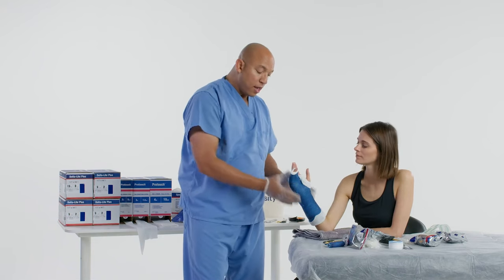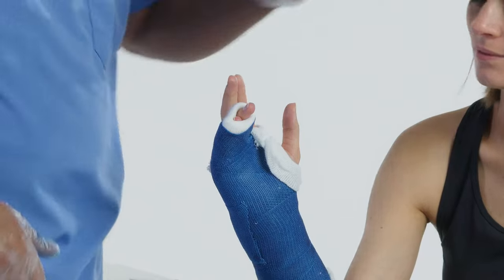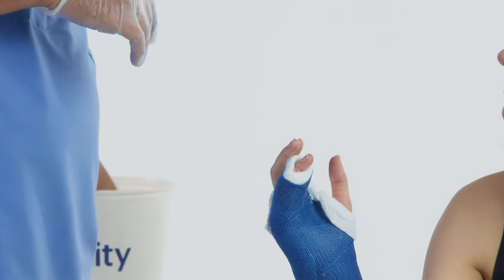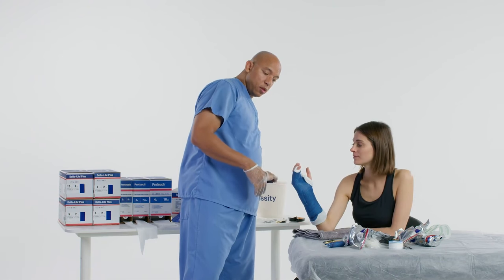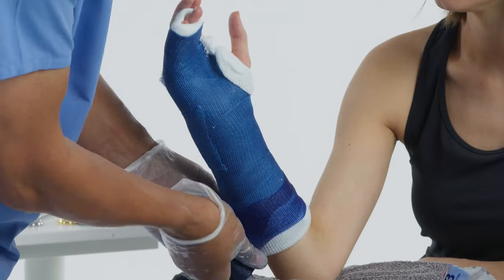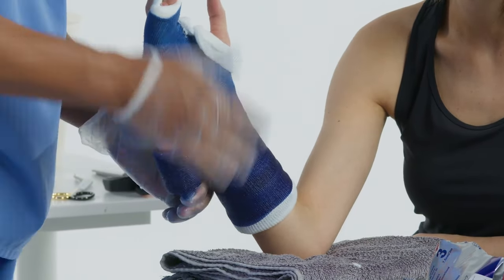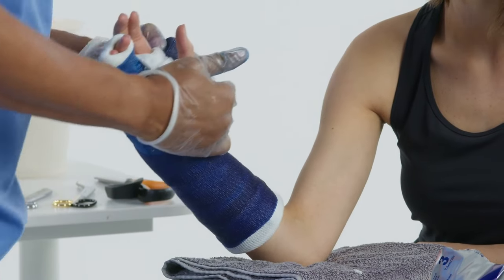I'm going to put more cast tape here and don't have to go on the fingers at all because I already put enough cast tape on the fingers. Let's open up another roll of cast tape, wet it, and finish off the cast. Another good reason for the splint is that hand surgeons may sometimes want the cast stopping at the proximal interphalangeal joint — if you have a splint there you can just stop it there and still have the strength where you need it.